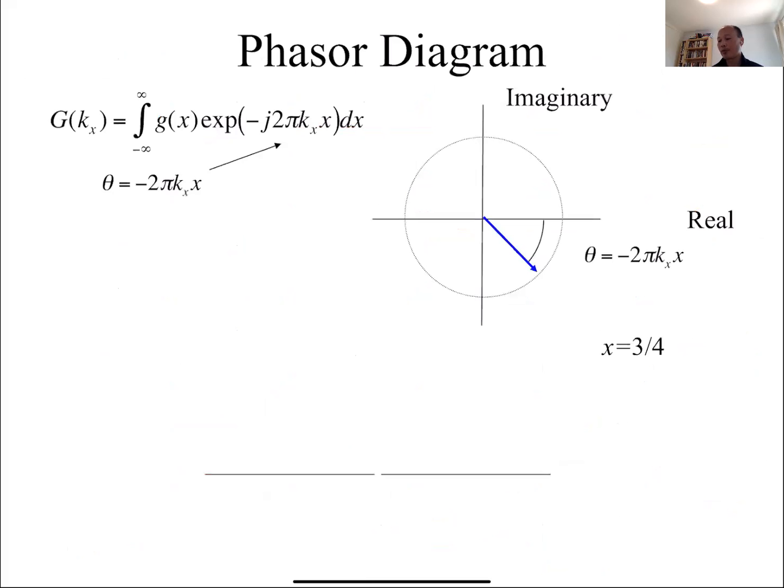Okay, so now we're going to review and try to put this into more mathematical terms so we can build up what we're doing with the MRI process. So recall that for a 1D Fourier transform, it spins so fast that it's backwards. Here's the way to think about it. Let's say we had people running around a circular track, right? So the race was around, you're running around a track, okay?